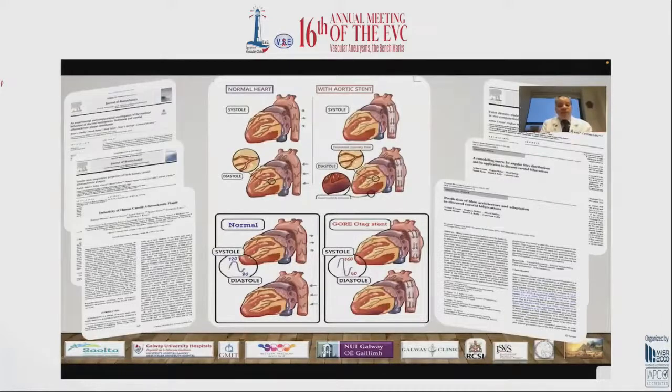Just to go back a little bit to physiology, we know that in the normal heart there is a systole and diastole, and during diastole the elastic recoil allows the filling of the coronaries. Then we looked at a lot of patients who had an aortic transection. These were young trauma patients, and we put in the best available graft on the market, without any comparison, the Gore graft. I don't work for Gore at all, but I'm just telling you. We see this in comparison with any other graft, whether Medtronic or Cook. Definitely we did very badly from the cardiovascular point of view, but it took up to 2 years for this graft to produce major cardiovascular problems.